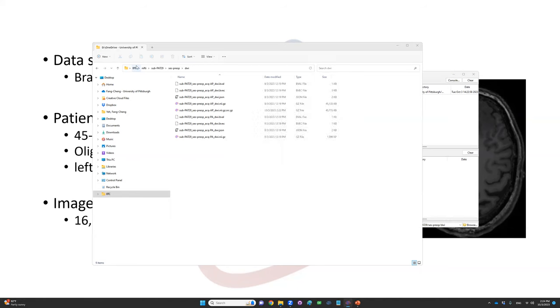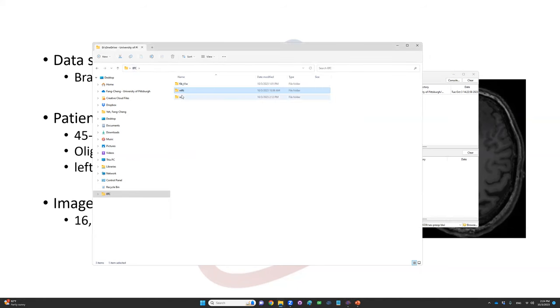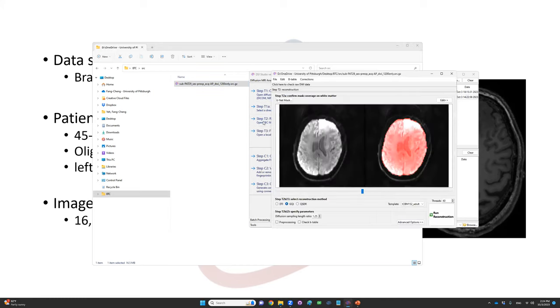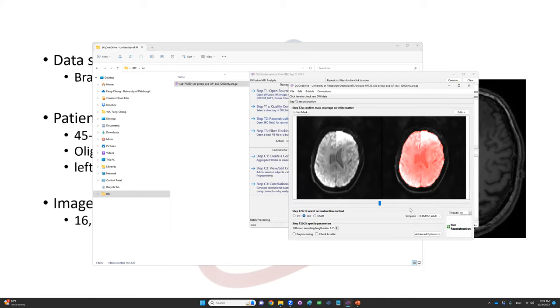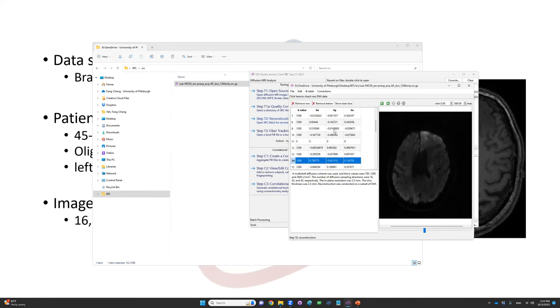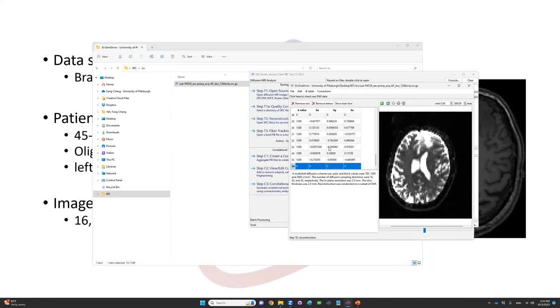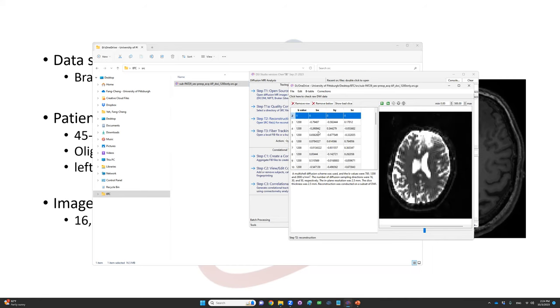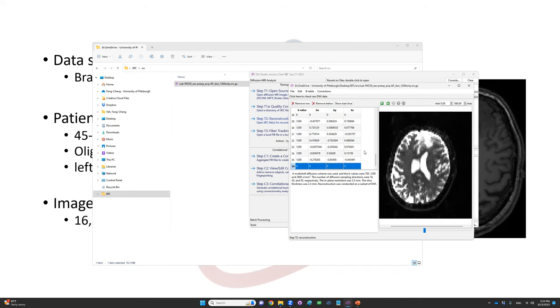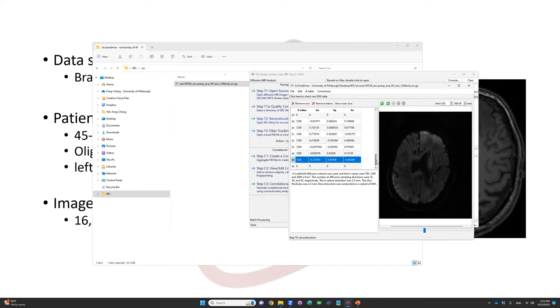Once we remove those, I can save as a new SRC file. I did that previously, so we can speed up the step and open this one with only the DTI acquisition range. Open this SRC file. There's a mask showing up, but we can double check and click on the first tab to make sure this b-value only has the 1200 range.